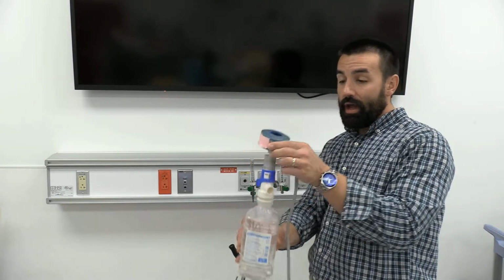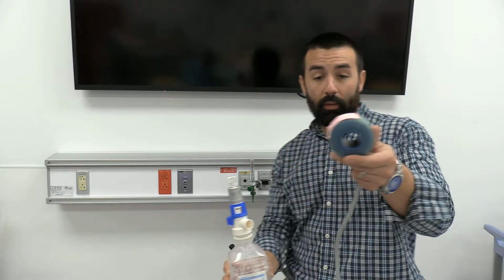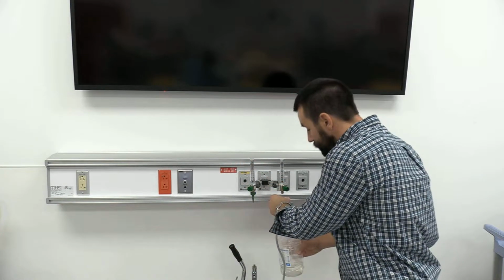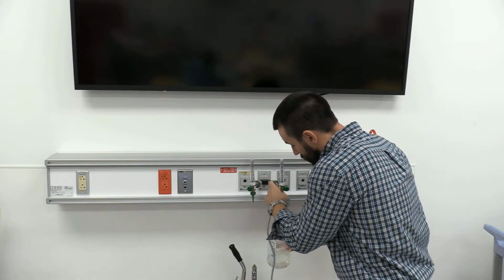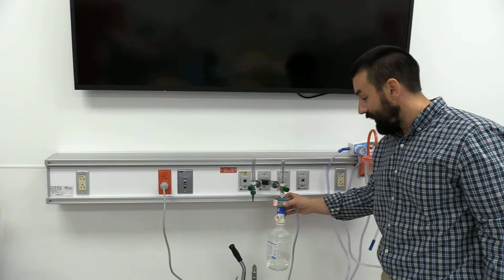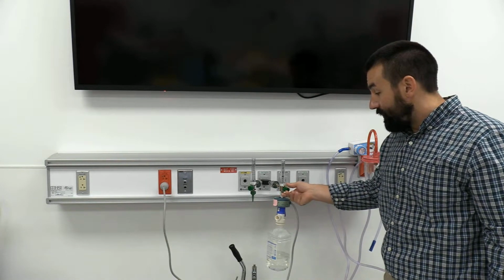So we slide this on. I do want to point out most of them have a silicone sleeve over it. You want the silicone sleeve on top because that's where you can burn your hand, snugging this thing off. So I'm going to thread this thing back on here. I'd plug this into the wall, and usually they'll have some sort of lighting system that lets you know the thing's on. So you can see my little green light there. Now, the problem with these is, once again, they're not as effective as something that can allow us to achieve a certain temperature and maintain that temperature the entire way to a patient.